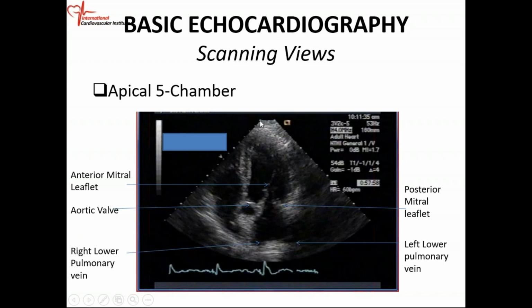So if you can do an excellent echo up to this point, you have completed 80% of the study. There are two more views, the subcostal and suprasternal notch view, where we're going to leave those views for our next session. But you know, this is a basic echo.